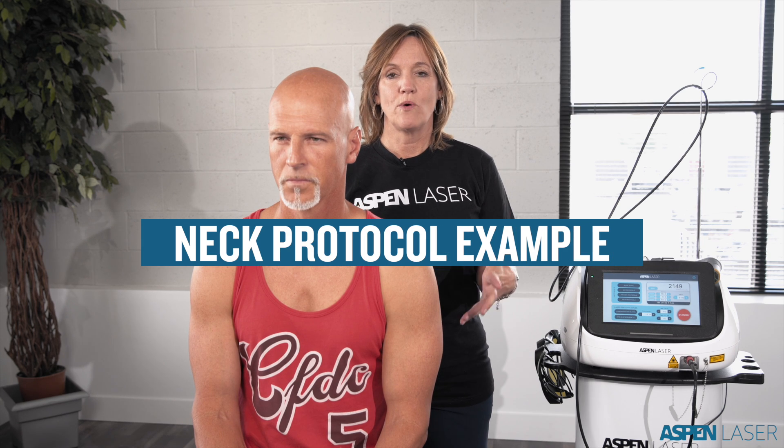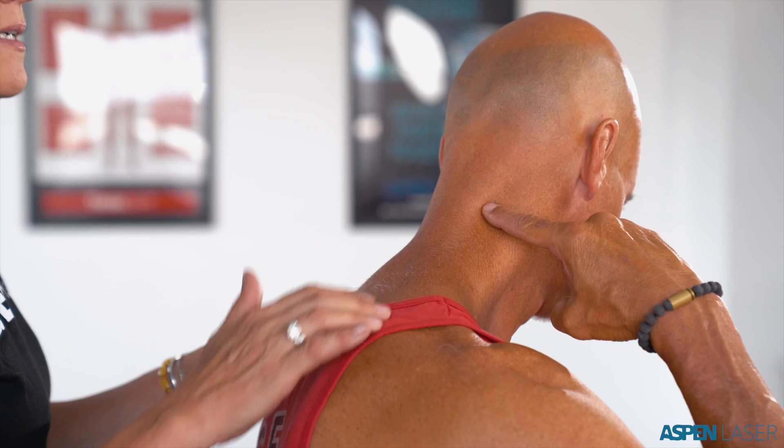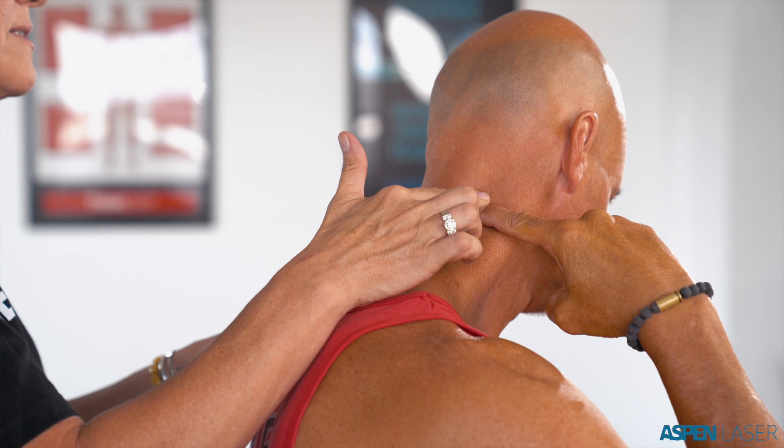The first step of my process is to identify where the client is feeling the most significant pain. I ask the client to point to that pain with their index finger, to where the center of their most prominent pain is. At this point, what is your pain on a scale of 1 to 10 at rest? Six.